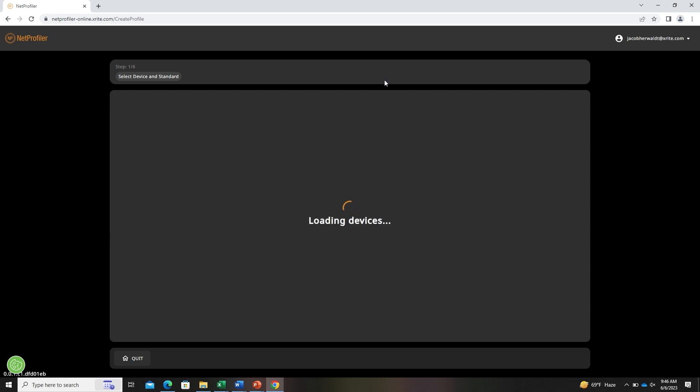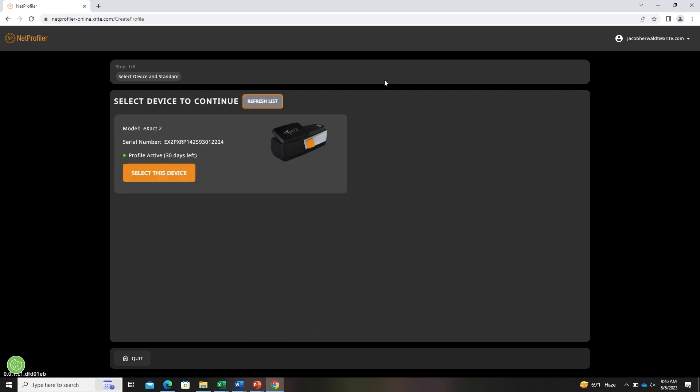Once launched, this will then connect any devices that are connected to the computer. From there, you can select any device that you would like to profile.